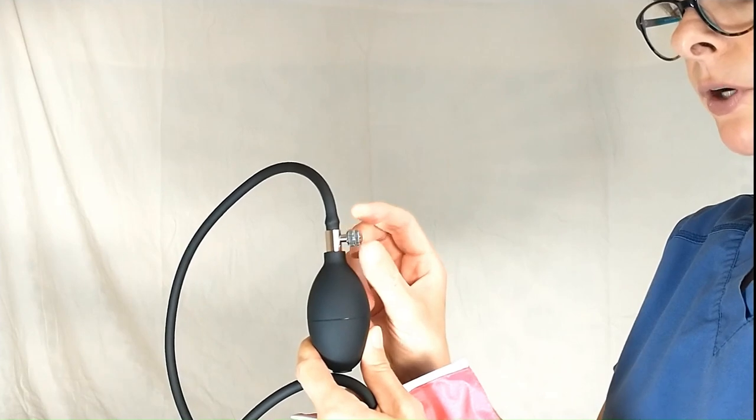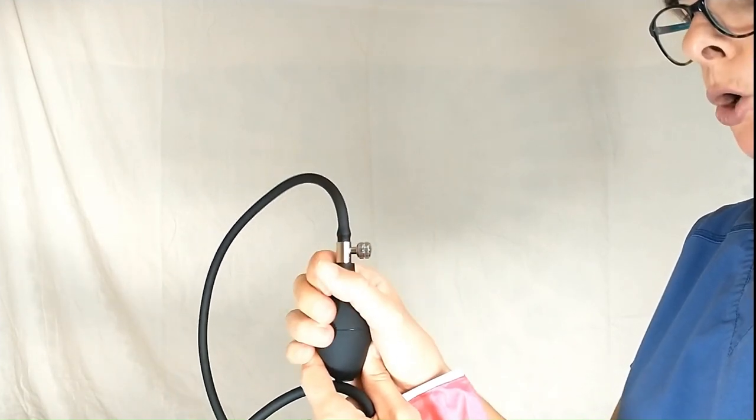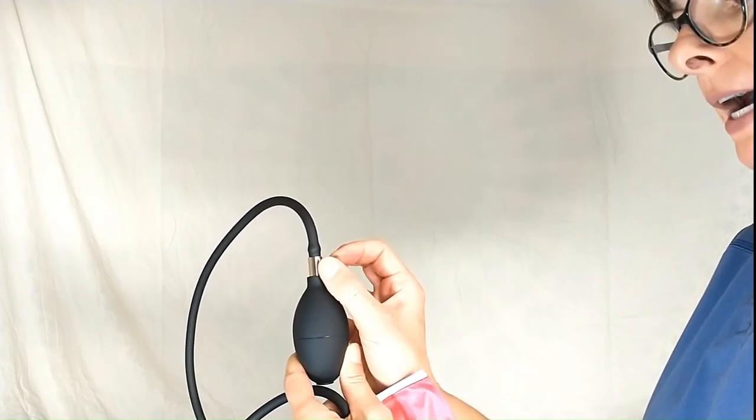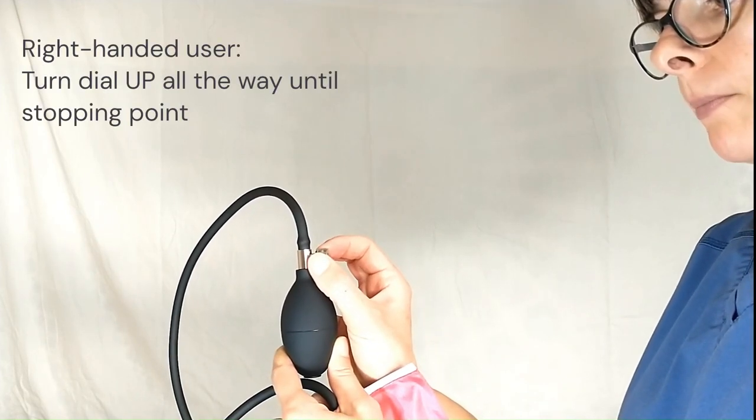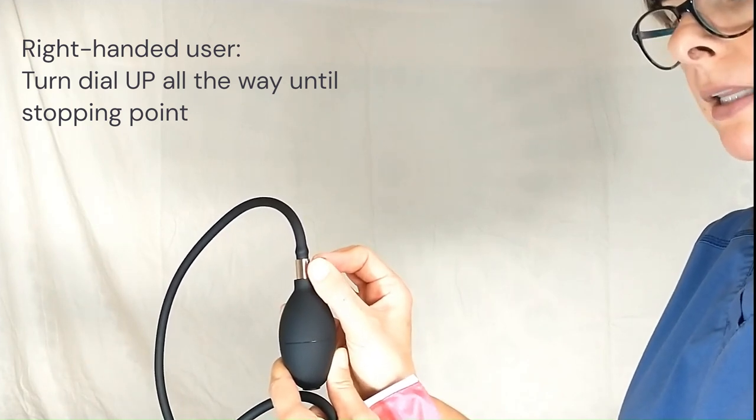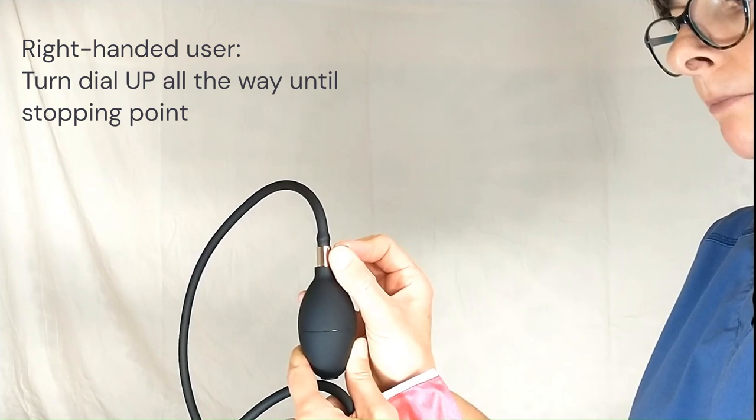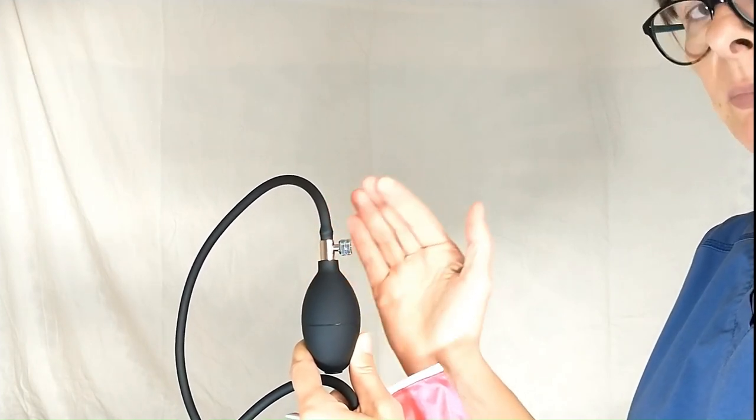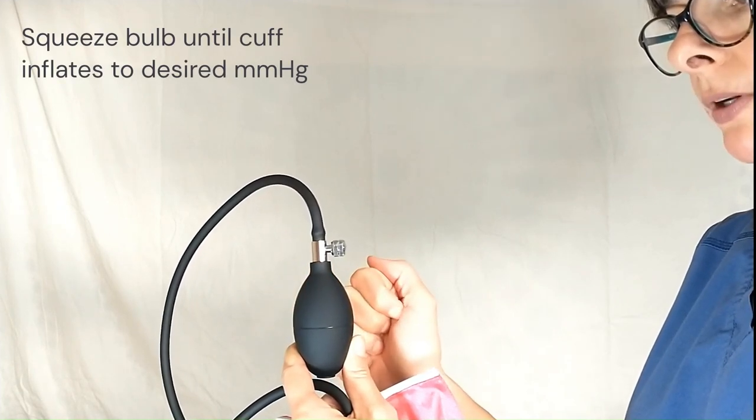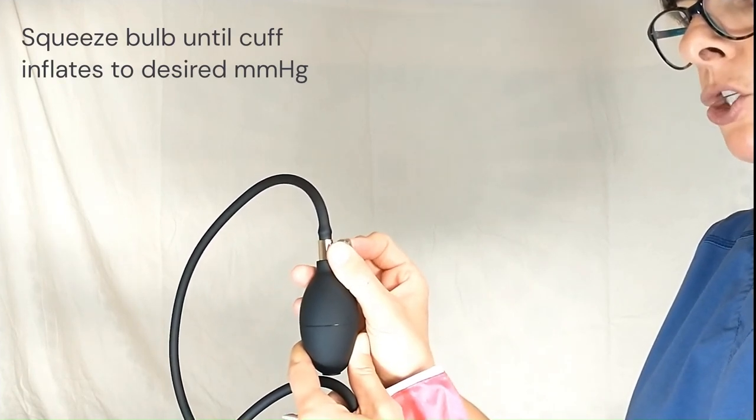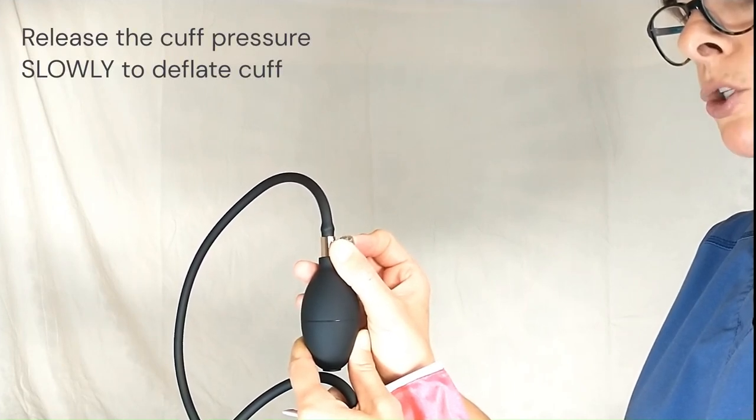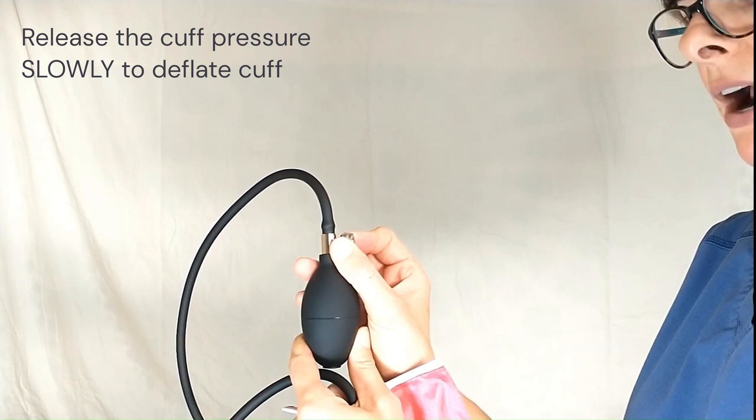Now this dial, if you're right-handed, I would recommend holding it in your right hand and then having the control of the dial with your index finger and thumb, and then dial it up all the way until it comes to the stopping point. Once it comes to the stopping point, that means that now it's ready to be inflated and you can squeeze the ball to inflate the cuff, and then gently move it with the index finger and thumb to deflate the blood pressure cuff.